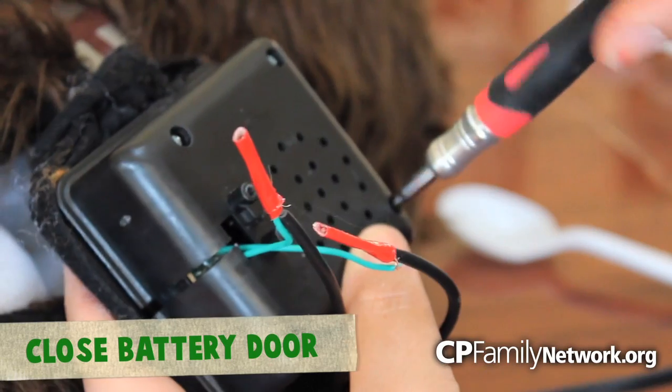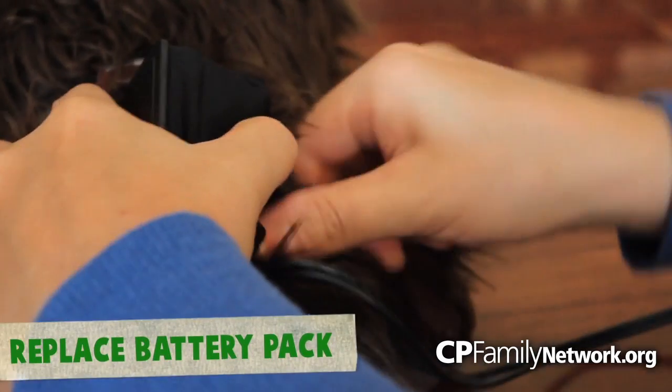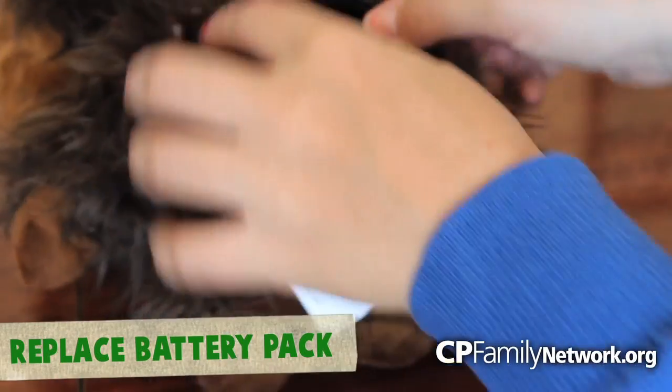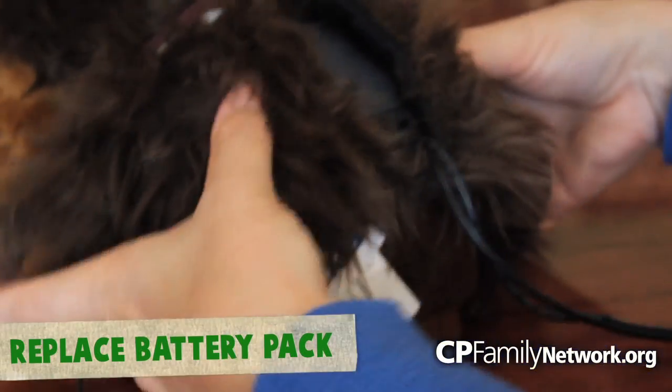Now, you can go ahead and screw the battery compartment back together. Place the battery compartment door back in — you can see the wire sit flush there. It's time to put the battery pack back inside the toy. You can use the velcro that's here on this toy or sew up the hole that you made.